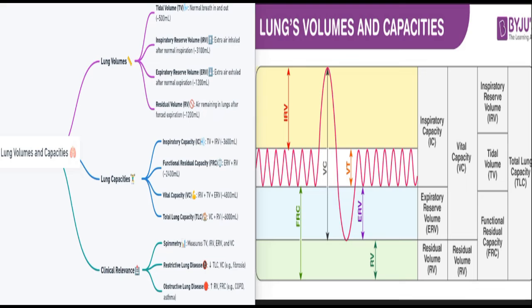Alright, so with the FEV1 and forced vital capacity ratio, generally an FEV1 FVC ratio of more than 70% in an adult is normal. So it's important in diagnosing airway obstruction, for example, airways smaller than normal. And so if you have an FEV1 FVC ratio of 0.75, that's normal.